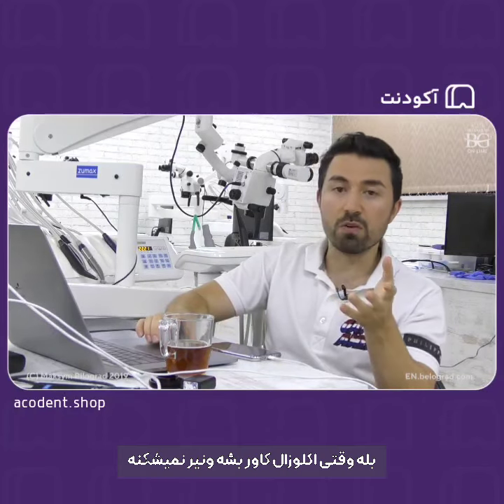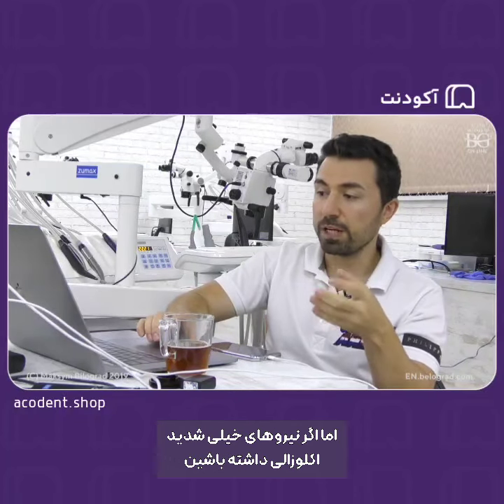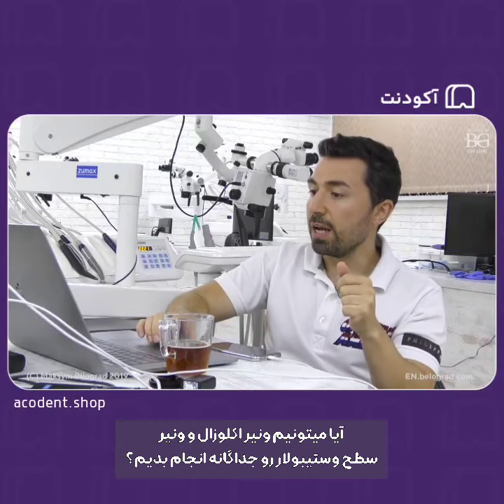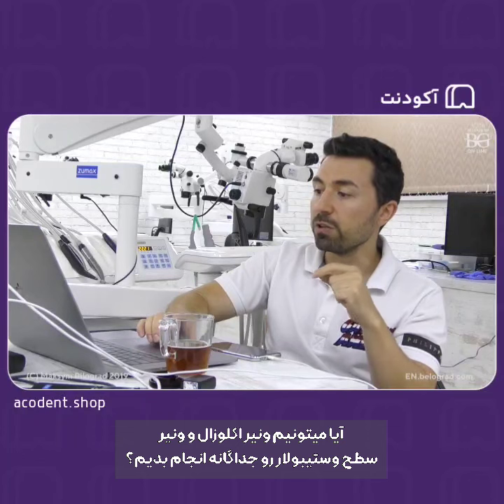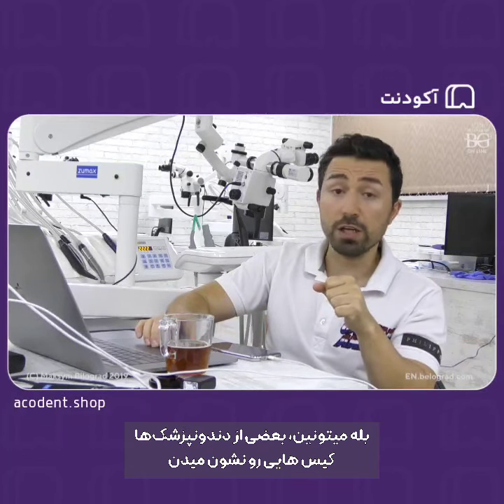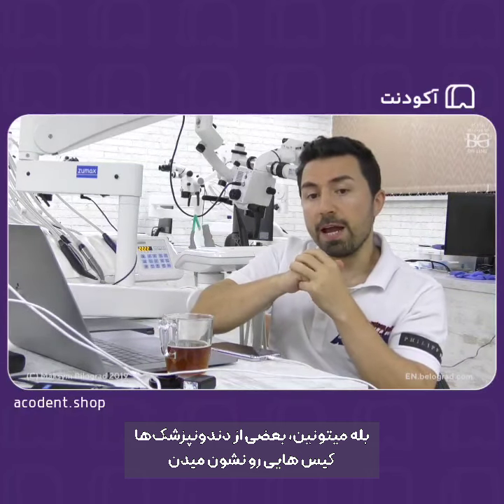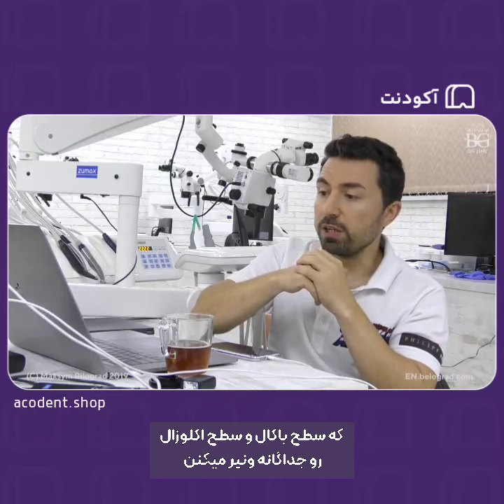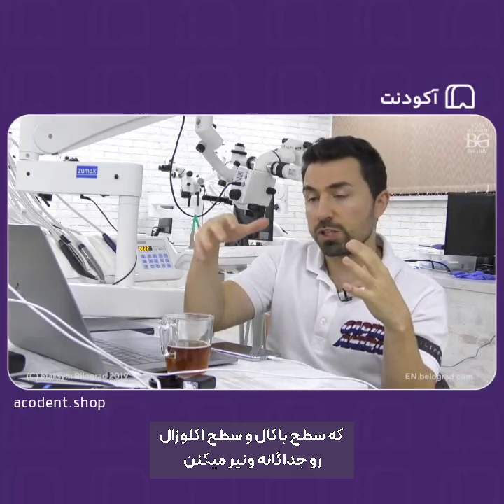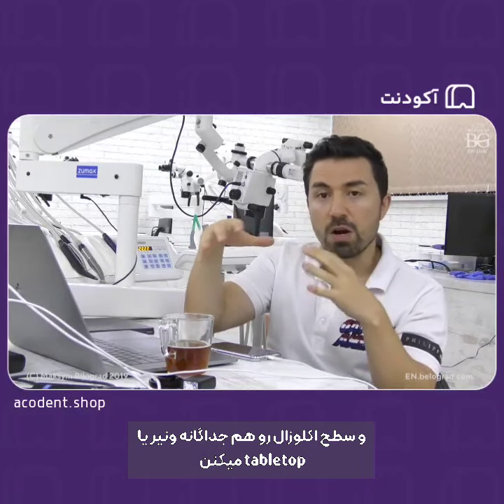Okay, next. When we cover the occlusal surface, the veneer will not break. Okay, yeah, if you cover the occlusal surface, the veneer will not break. It may break if you have extreme occlusal loads, for example, or super contacts. And can we do the occlusal veneer alone and the vestibular surface alone? Actually, you can. There are some clinicians who show cases where they make a veneer separately for the buccal surface and a veneer or tabletop restoration as a separate restoration for the occlusal surface.